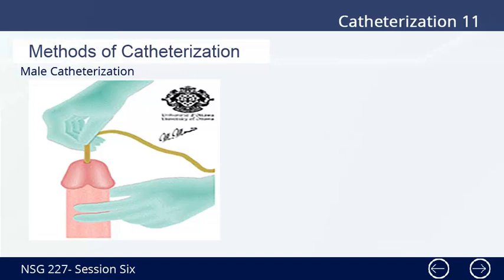5. Generously lubricate the tip of the catheter for about 15 to 18 cm and place the drainage end in the collecting basin. Resistance may indicate stricture of the urethra or prostatic enlargement obstructing the passage. 6. Lift or grasp the penis firmly with your non-dominant hand, which is then considered contaminated.